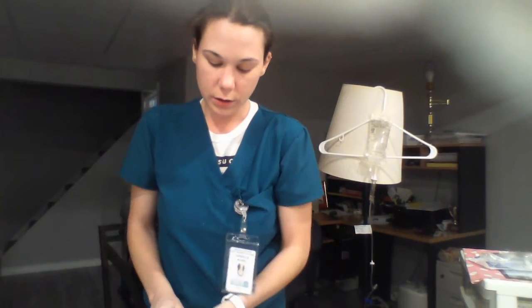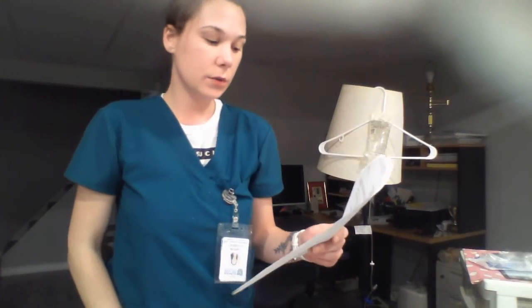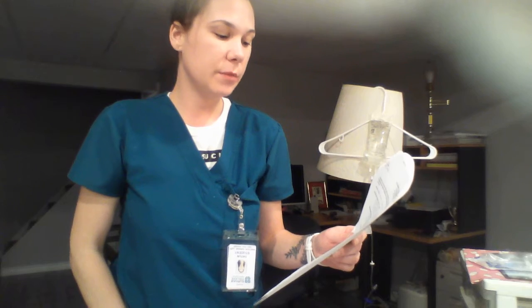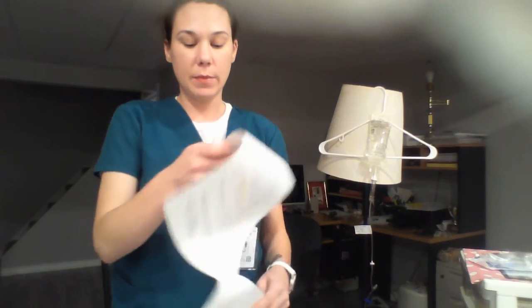So I'm going to refer to my monograph, and I want to just know the diluent and the time to infuse over. So the diluent is between 50 and 100 milliliters of IV solution, and to infuse over 10 to 60 minutes. Using clinical judgment, I'm going to choose to run this bag over 20 minutes today.